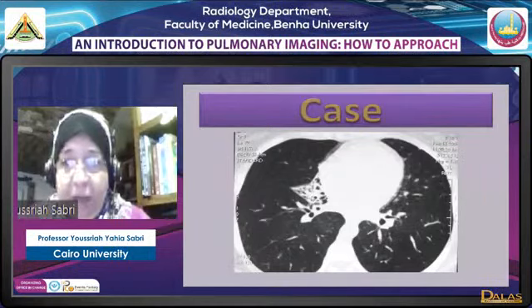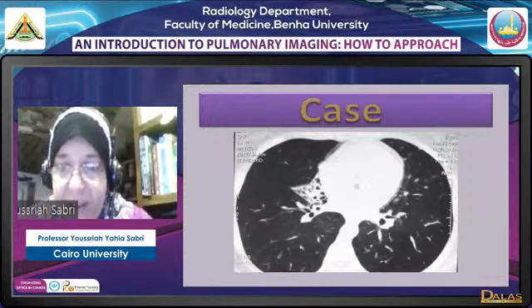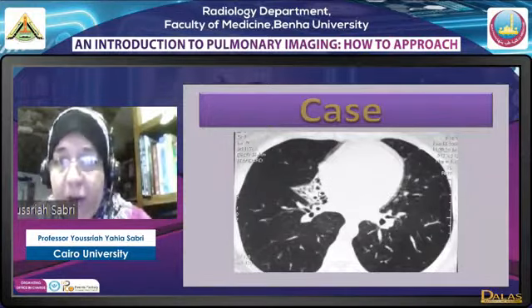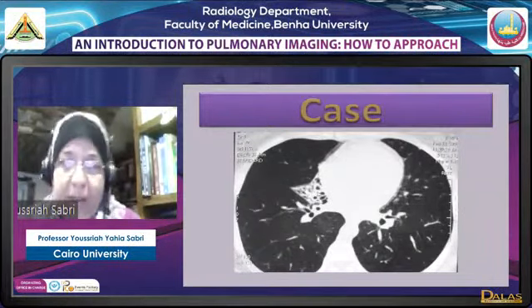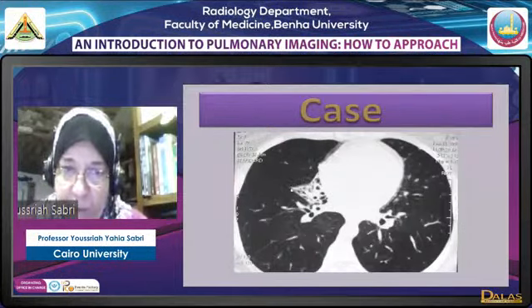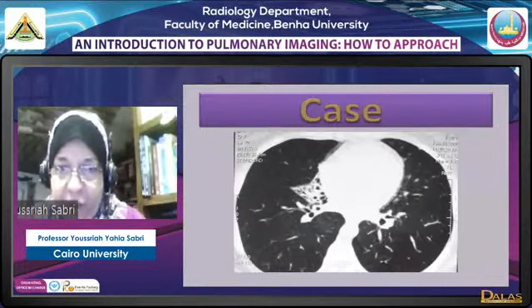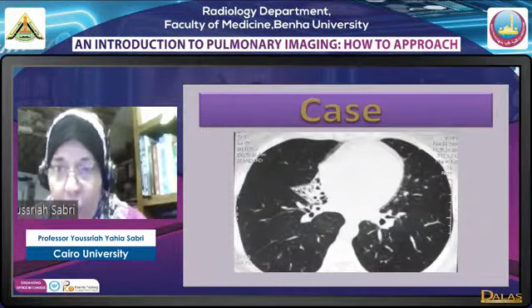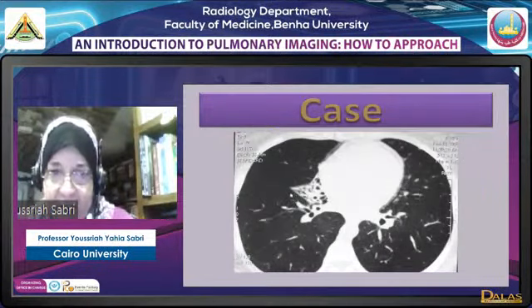Collapse of what? What part of the lung has collapsed? We have a triangular opacity between two fissures. This triangular opacity is related to the heart. What part of the lung is related to the medial, to the right aspect of the heart? This is the middle lobe. So this is a middle lobe lesion with demarcation, meaning that I've reached the fissure, meaning that the whole lobe is affected. Is this a proper site of the fissure? No, it is not, because this fissure has moved toward the lesion. The lesion has regressed in size, and it is demarcated by the minor and major fissures. This is a total cicatricial collapse of the middle lobe in a female 18 years old.